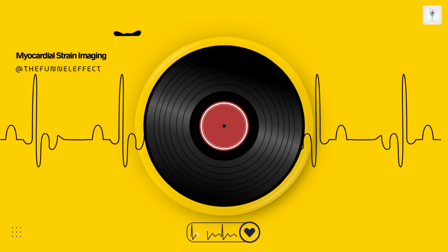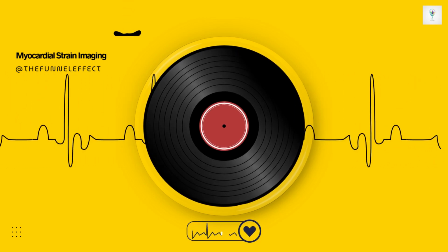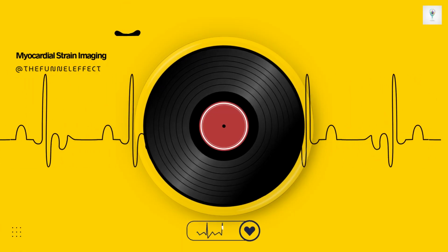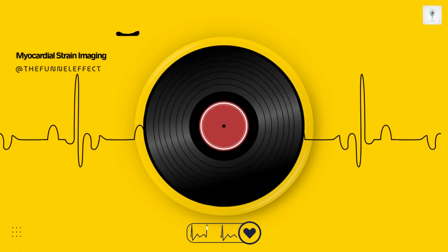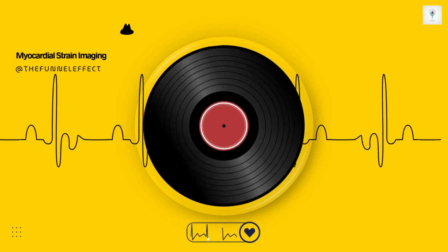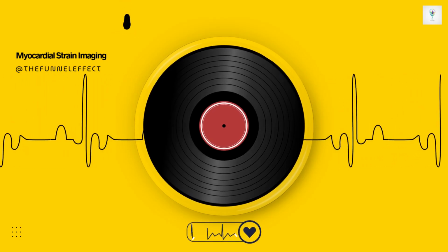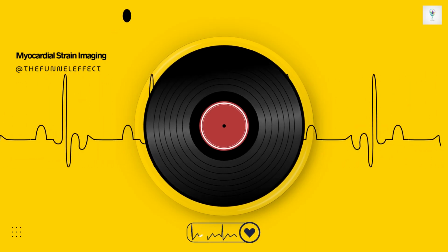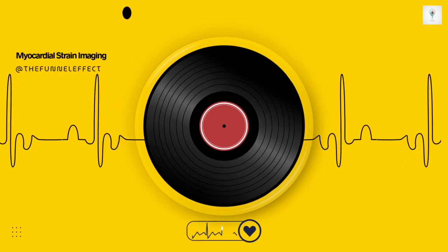What was its strength? Its incredible speed. TDI had a fantastic temporal resolution. We could get frame rates up to 300 or even 400 frames per second. This was actually really good for assessing strain rate and those very short high-speed events like the isovolumic contraction phase before the valve opens. So if it was so fast, why did the field largely move away from TDI towards the slower 2D speckle tracking method?